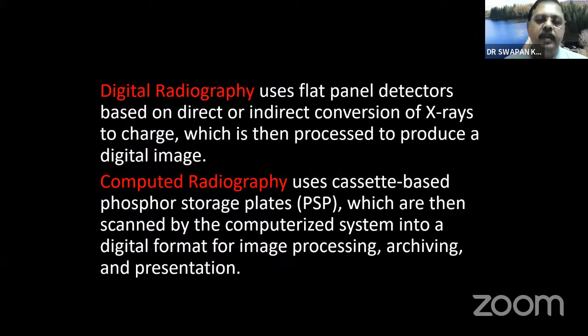So before going to the details of the radiology or X-ray of the chest or any other thing, you must have heard of, seen, analog X-ray. Analog X-rays are the old X-ray machines that have been used to take a picture, which is processed in a film, and that has to be developed and then dried and then sent over the view box.